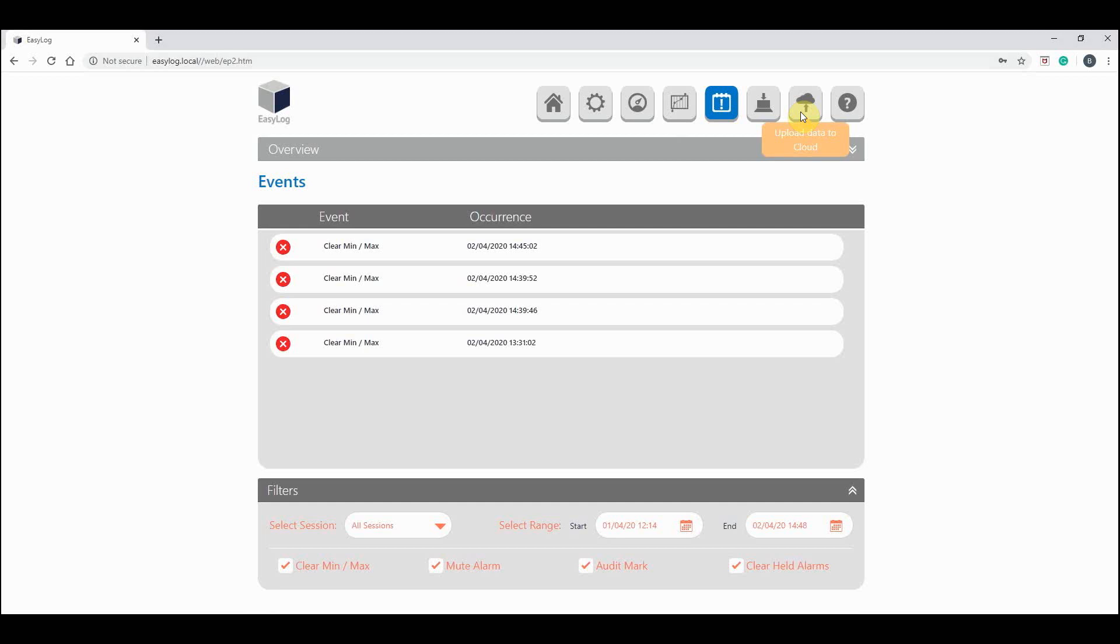To upload your collected data to the cloud, click the cloud button. Once pressed, you will be asked for your cloud account details. For more information on this, please watch our ALSI cloud tutorial on the EasyLog YouTube channel.